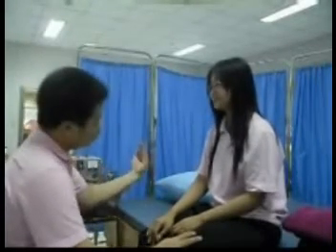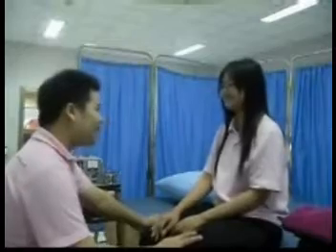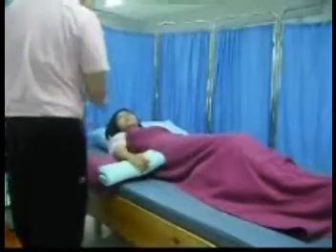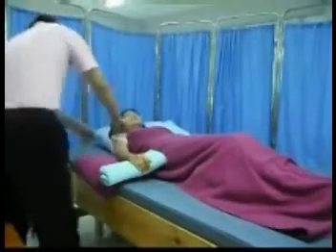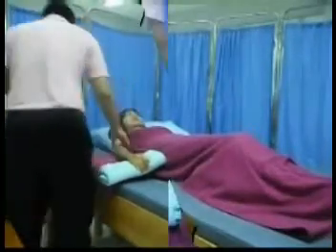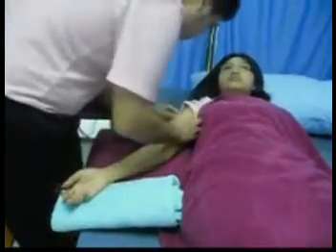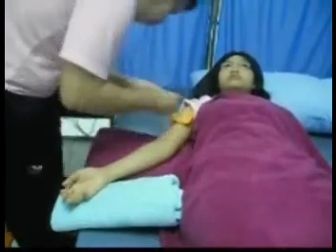Second, choose the optimal electrode for the treatment area. Third, explain to the patient about the method, sensation, effect of treatment, and treatment time. Check contraindications for electrical therapy.